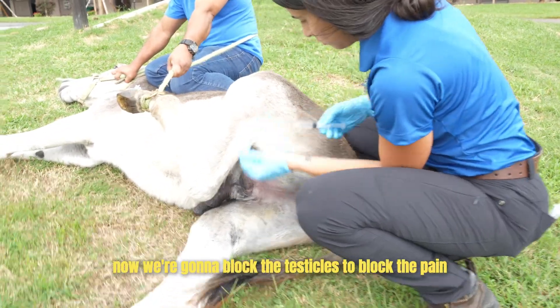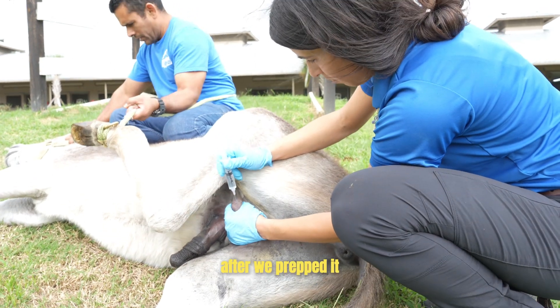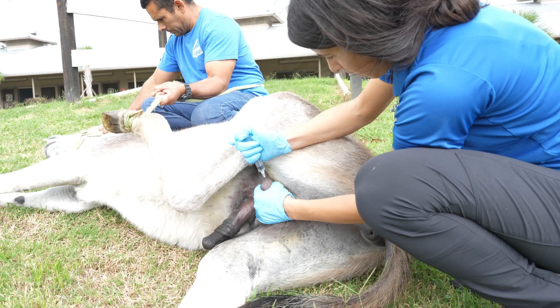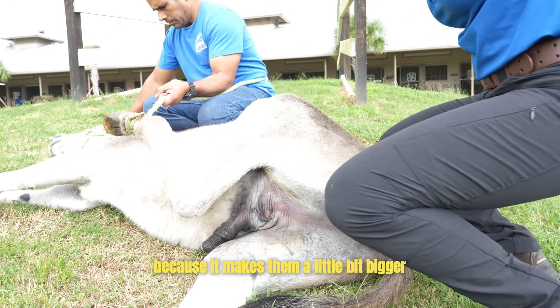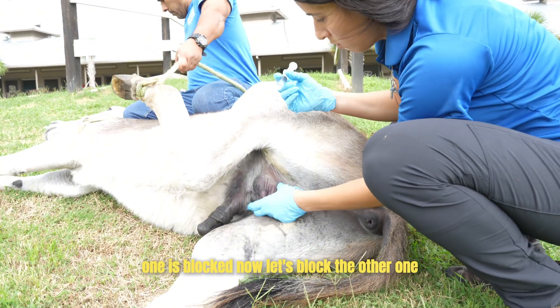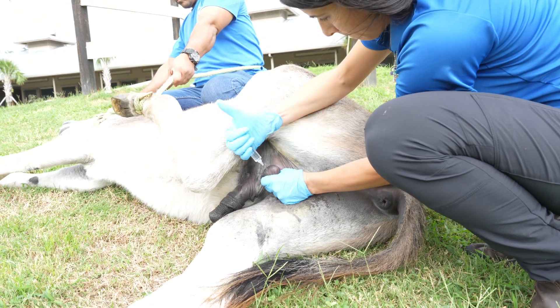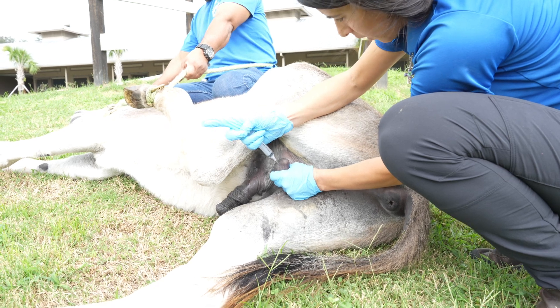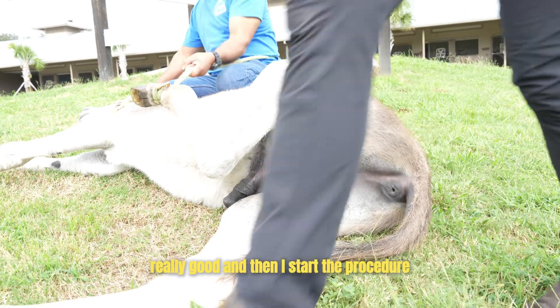Now we're going to block the testicles to block the pain after we prepped it, and it also makes the procedure a little bit easier because it makes them a little bit bigger. One is blocked — now let's block the other one. Second one is blocked. Now I clean it really, really good and then I start the procedure.